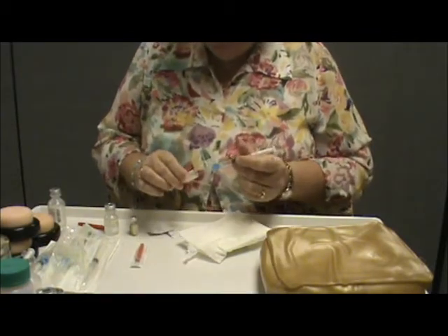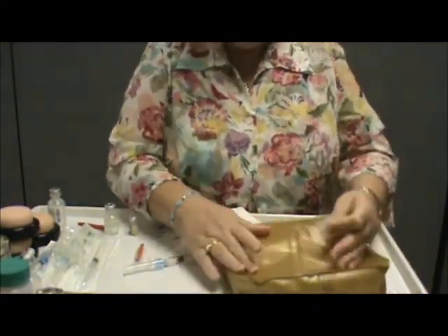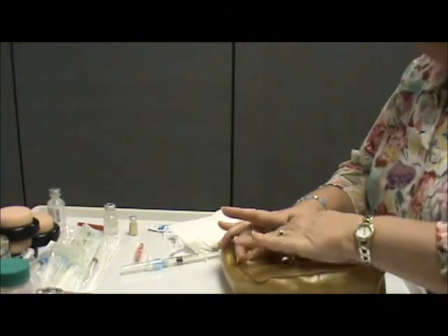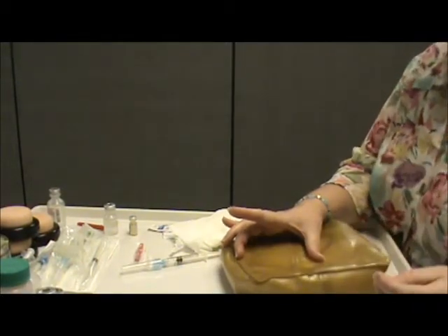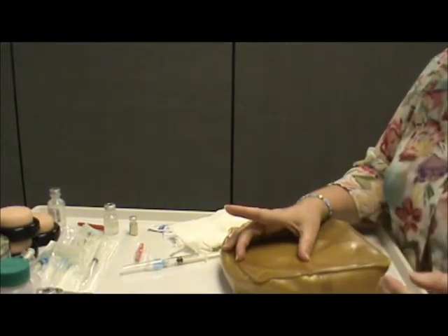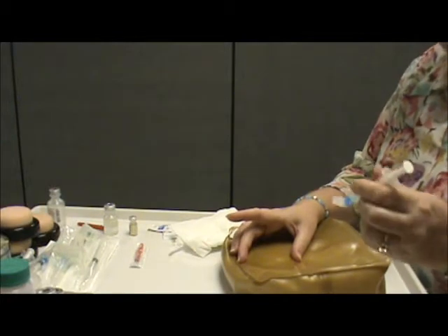Okay, so I come to my patient bedside. I'll show you the sites here in a few minutes, but right now for injection technique, what I'm going to do is cleanse my site in a circular motion. I'm going to go from inner to outer, and then I'm going to allow that to air dry. Take your swab, stick it between your two little fingers. You're pulling your skin taut, and we'll say this is totally dry now. I have my skin taut.